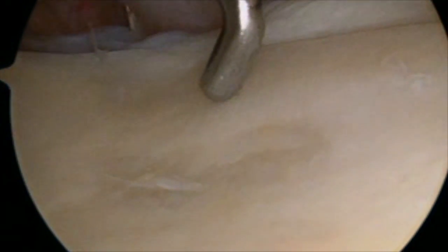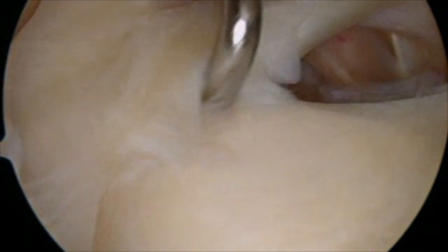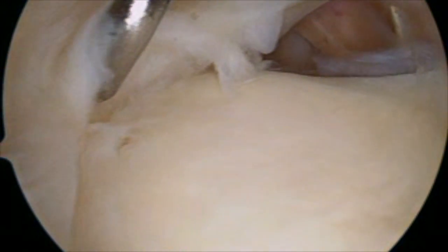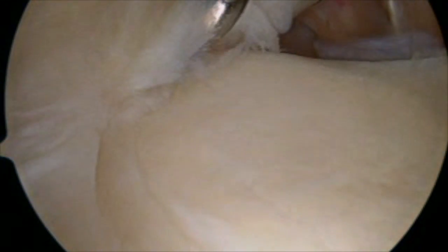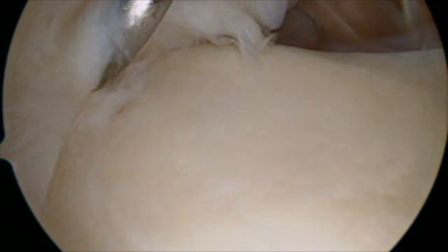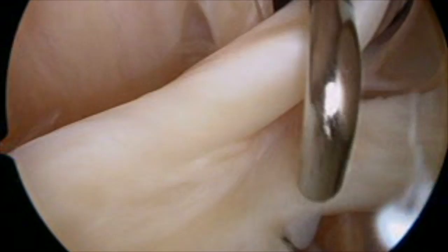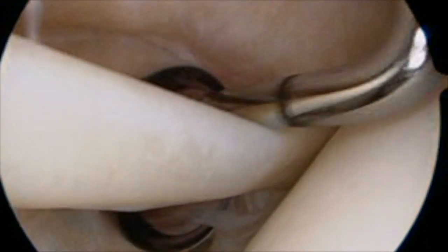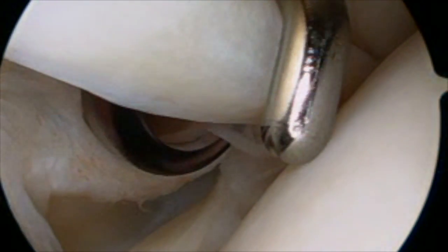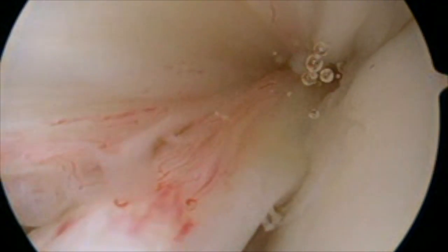Once we see the ligaments are fine, we're going up to the top of the shoulder. Now we're feeling the superior labrum, where the biceps anchor is. This patient might have a touch of a type 1 SLAP tear or a little frayed labrum, but the anchor itself feels stable. So I will definitely clean this up and just trim out that little small tear. Next, I hook the probe over the biceps and I test the stability of the biceps. I basically hook it and pull it down and check the sling. Once I start pulling it down, I can see that the sling on this patient is intact. It's a very common injury to have a sling disruption in biceps instability.